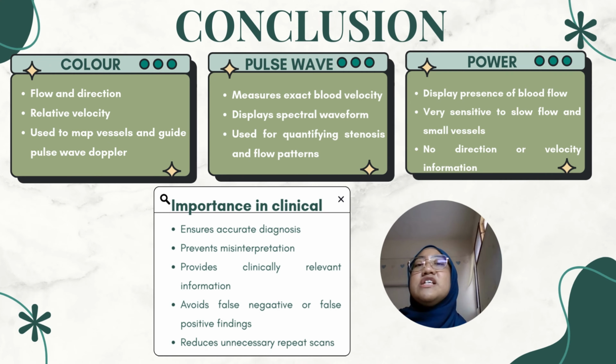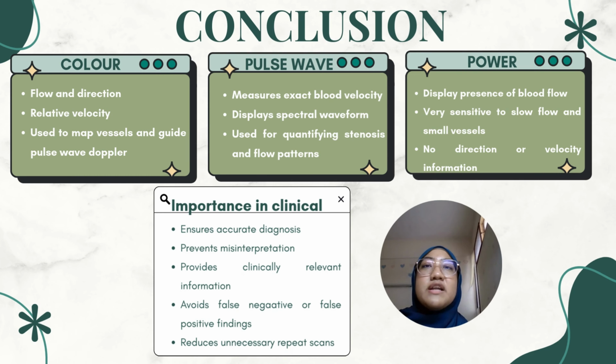To conclude, each Doppler mode has its own use, strength, and also limitation. However, it is very important for us to know each use and suitability of the Doppler mode. This is to ensure accurate diagnosis, prevent misinterpretation, provide clinically relevant information, avoid false negative or false positive findings, and also reduce unnecessary repeat scans.